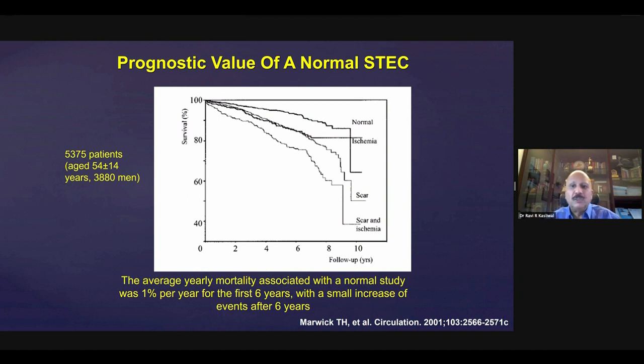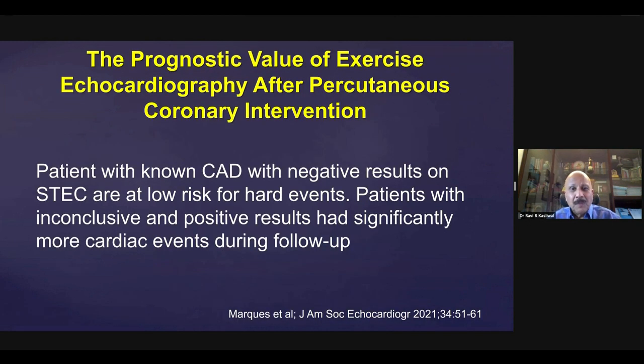It's not about rushing patients to the cath lab, but it's telling the patients that, look, either you are safe or you're not safe, that you've achieved your target heart rate of 85% and above, but in that you have not demonstrated any changes.